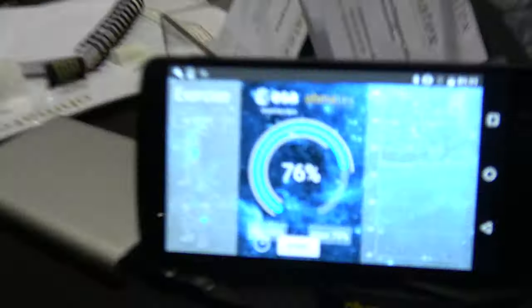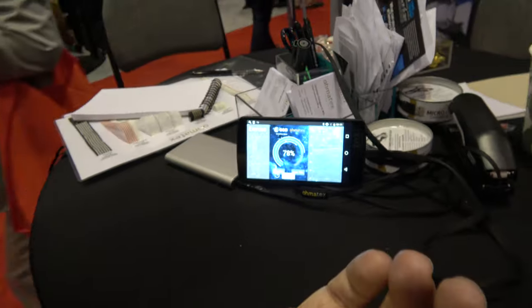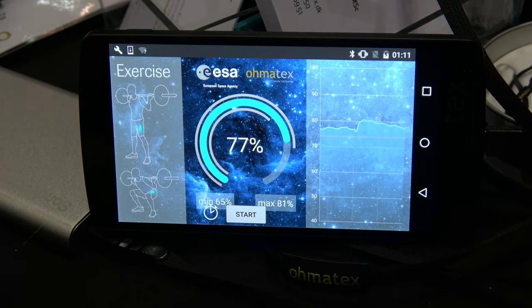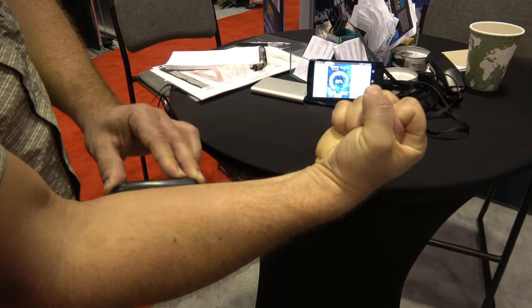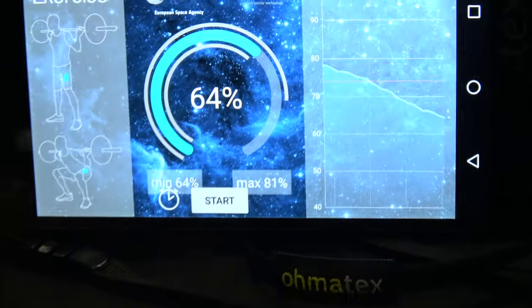It's showing the oxygen levels inside the muscle — looking for medical device applications. If I try to tighten the muscle and keep it tightened, you'll be able to see the curve starting to go down. You can see now it comes down very fast.